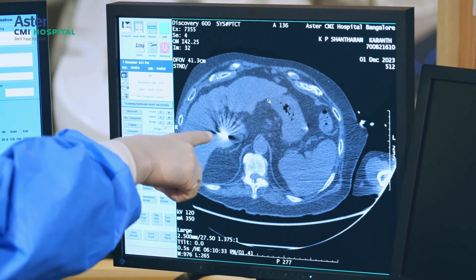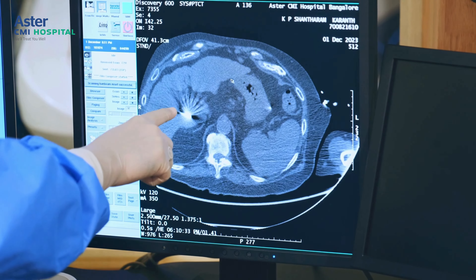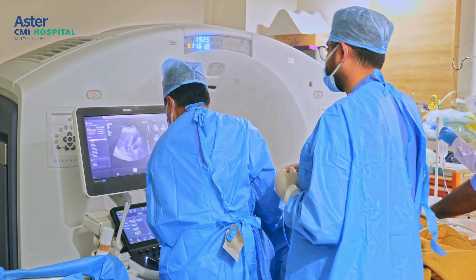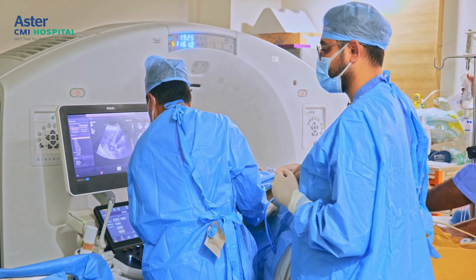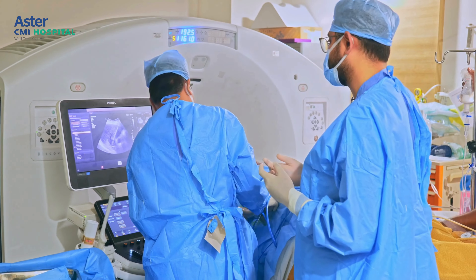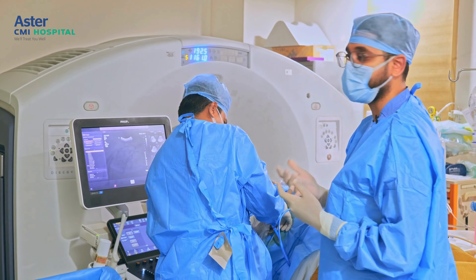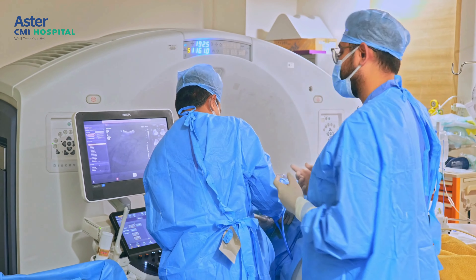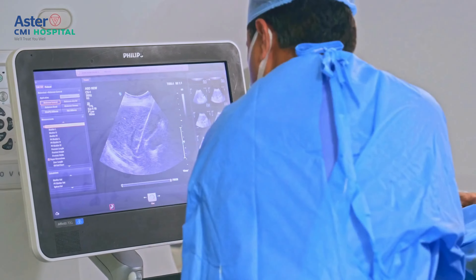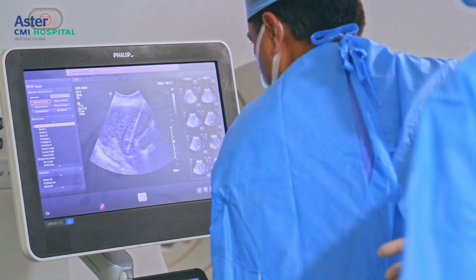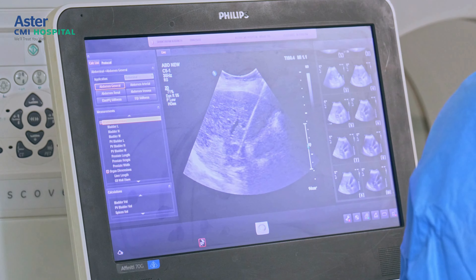We have done a check CT. The needle tip is seen within the lesion — we are happy with the position and will go ahead with the ablation probe. We have our settings ready — how much power and for how long to burn the lesion. There is a pre-loaded sheet; depending on the size of the lesion, you choose both the power and time duration. We are going ahead with about 80 watts for about 12 to 13 minutes. We can already see a small hyperechoic area around the needle — the ablation has just started.